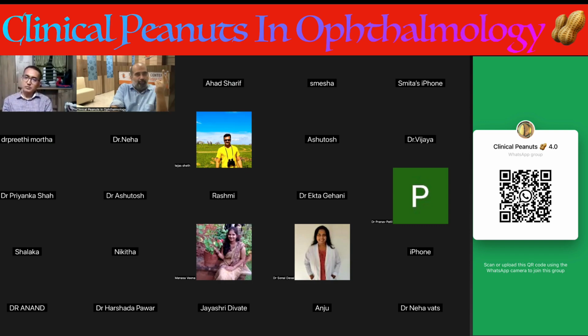So putting 2 toric IOLs, would you? No, I mean one plain and one toric, or one toric and then calculate and put another toric. This is also something people are trying.